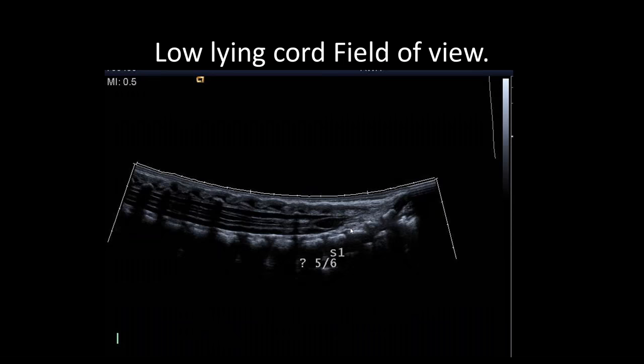Okay, so the next question for you, Cheryle, is there any merit in performing MCA Doppler if there is no obvious abnormality? I don't think there's any value. I mean, the main use of middle cerebral artery Doppler is in babies with hypoxic ischemic encephalopathy. So you're looking to see if they've got reperfusion injury. The second reason you're looking at middle cerebral arteries is if you think that you have an infant with a stroke, and some people have documented seeing poor middle cerebral artery flow on the affected side, as you might see in an MRA.